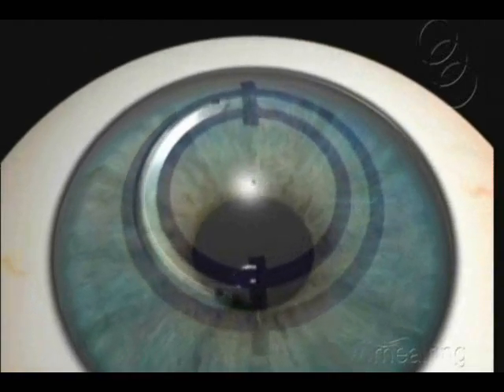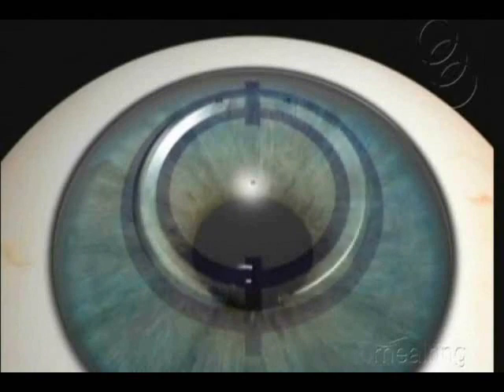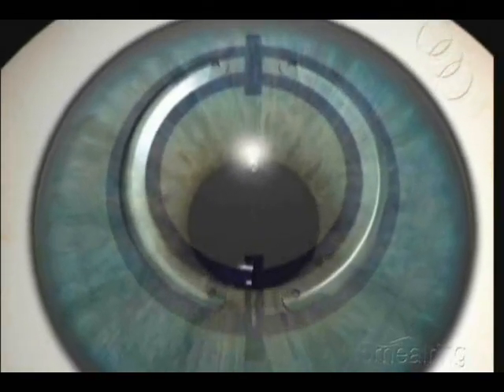When implanting two segments, one just has to make the same procedure at the counterpart side.